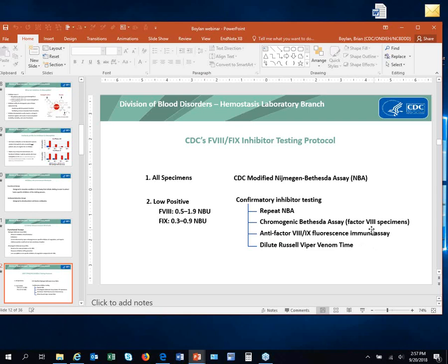And this is something that we've thought about exploring, but there's a ton of work that needs to go into validating the usefulness of a different type of screening procedure as your front line. It's possible that would turn out to be a better way to do it, but we would have to do a lot of background to figure out if that's indeed the case.